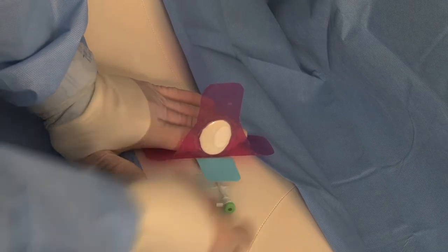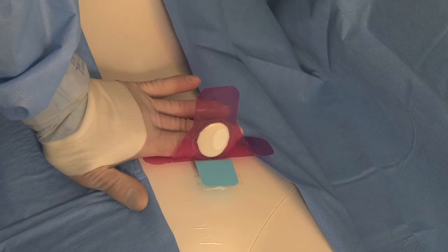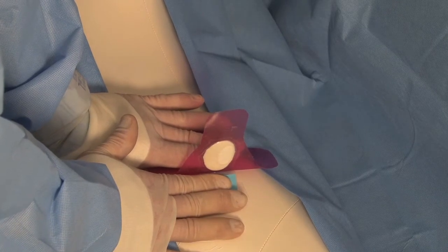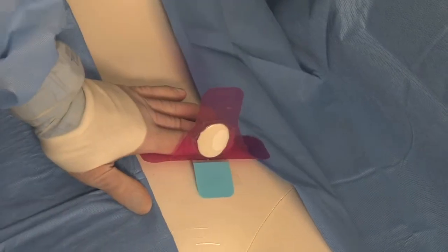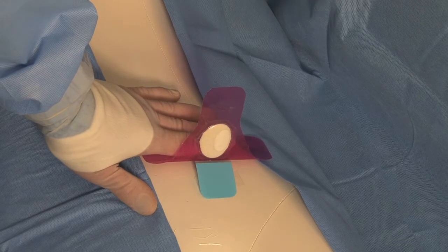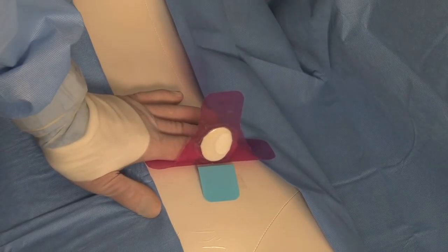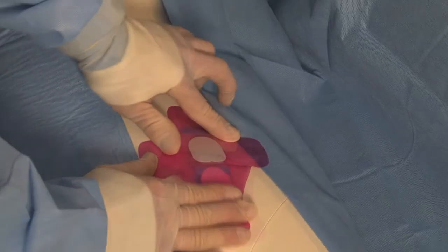The sheath would be removed from the femoral artery, applying pressure to the pressure pad assist device. The chitosan pad would then be pressed into place over the puncture site. Approximately 10 minutes, hemostasis will be achieved. At that point, you would assess the site for bleeding. If successful hemostasis has occurred, you would then remove the remaining backing on the adhesive on the inferior aspect of the dressing, closing the chitosan in place.